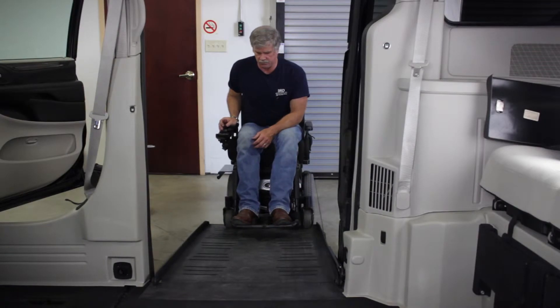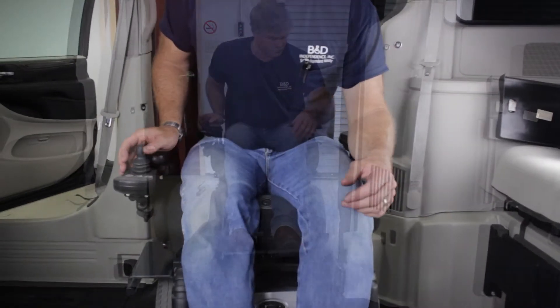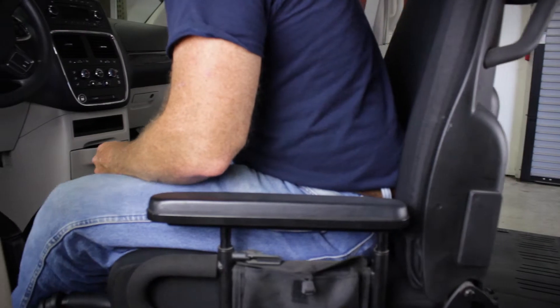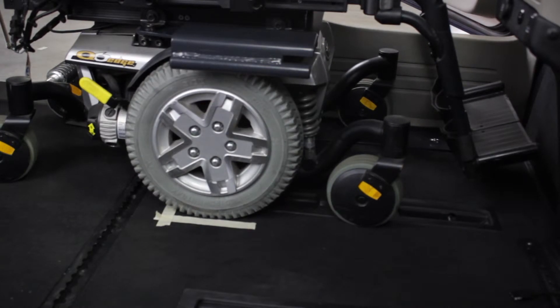At this time, drive the power wheelchair into the minivan. Do your best to locate the power wheelchair to an area that will allow the driver or passenger to sit comfortably and still control the steering wheel. Once you have located the power wheelchair to the appropriate area, mark this area for future reference.